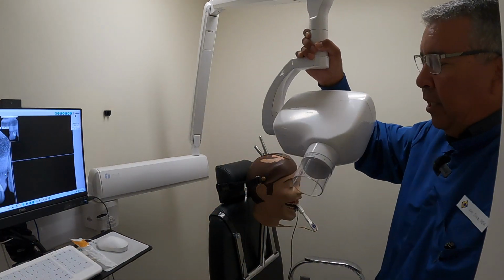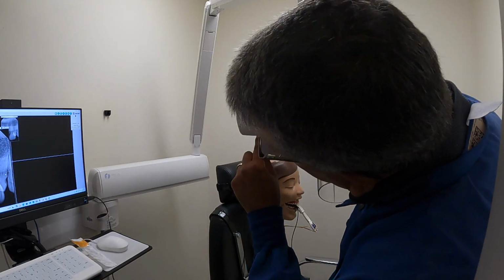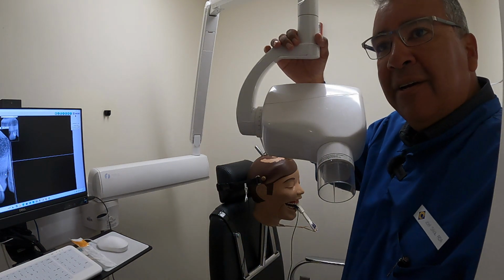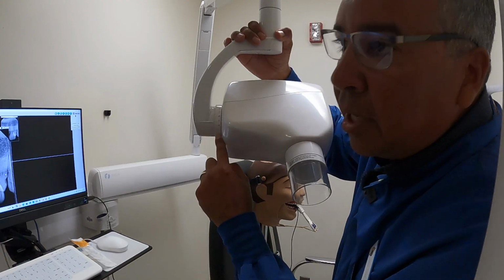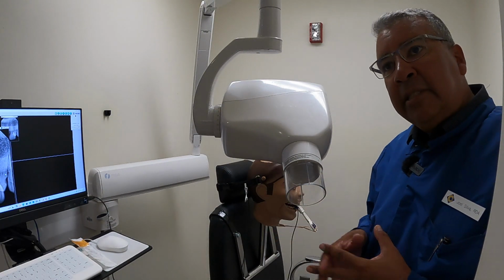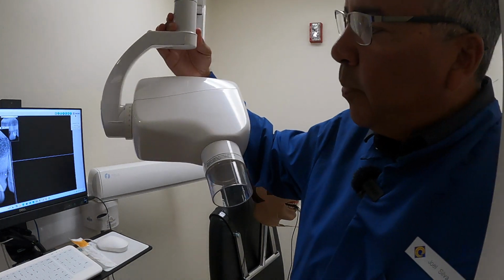In the front of this PID, remember that you have angles already set up for you. They're on there. I said that if you have 0 right here and this bar is on the numbers above it, yeah, if that line is going to numbers above that 0, we're in the positive. And I know this looks down, coming in at an angle going down, so it kind of messes with your head a little bit, thinking, well, it's negative, but it's not. This is in the positive territory.